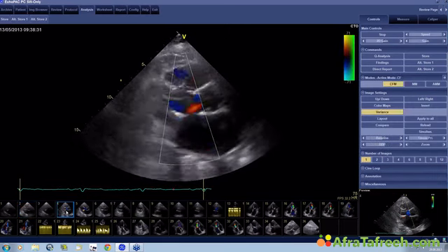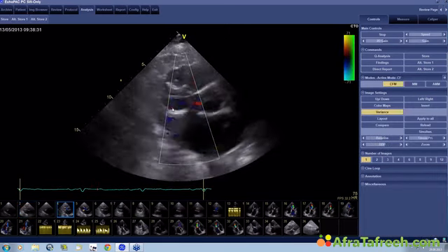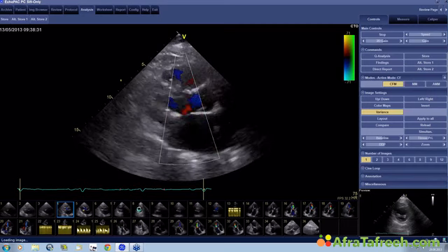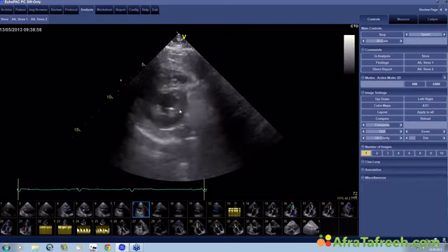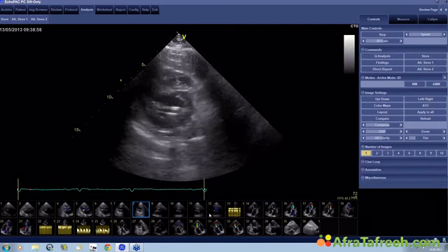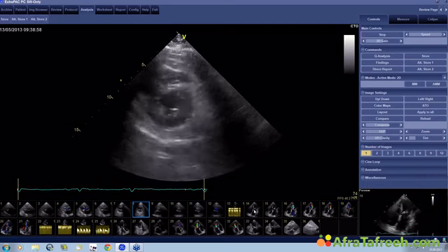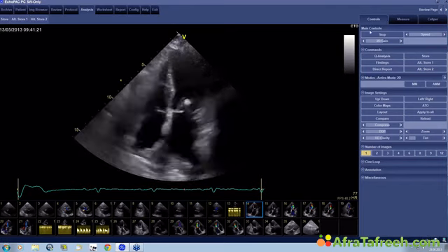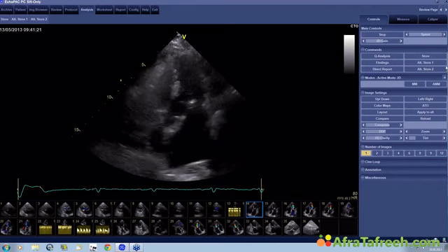Okay, so here is the color flow, which shows you that there's turbulent flow through the mitral valve, and then you can go to the short axis view. You see a bit of thickening of the subvalvular apparatus. These images are not of very good quality, but the apical views are, and this will show you now more about the morphology of the valve.